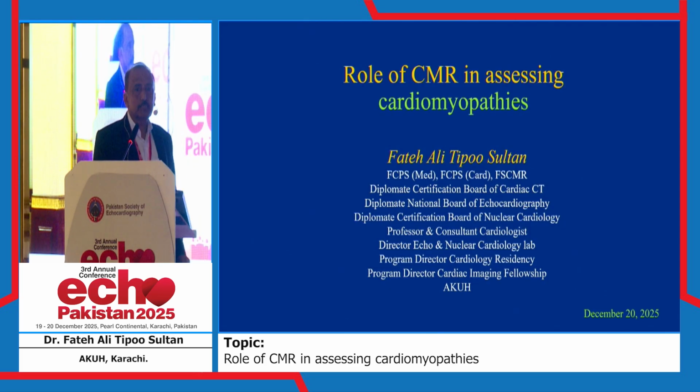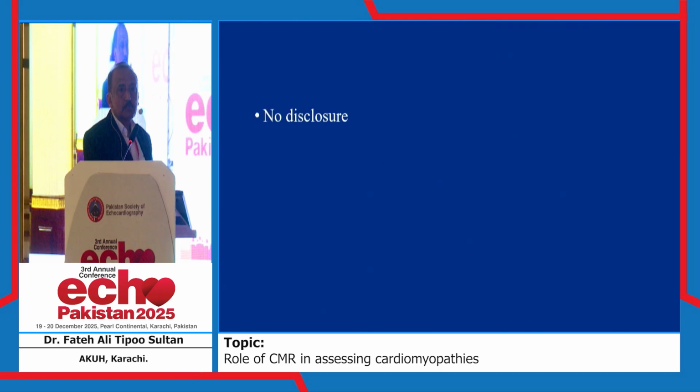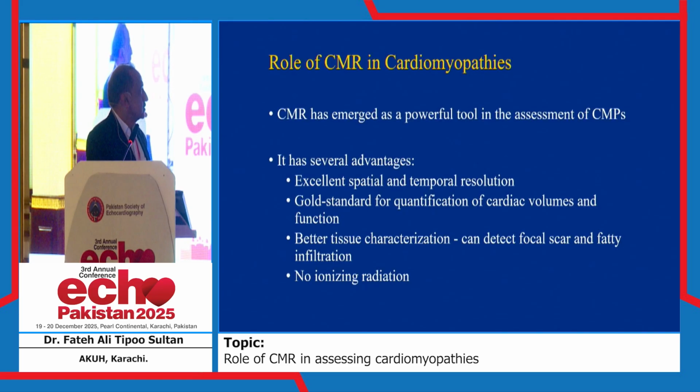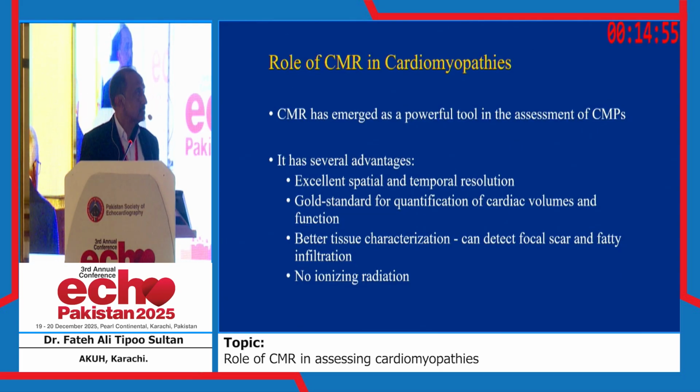The topic of this talk is the role of CMR in assessing cardiomyopathies. No disclosures. CMR has emerged as a powerful tool in the assessment of cardiomyopathies.